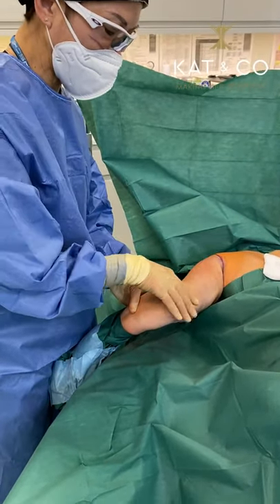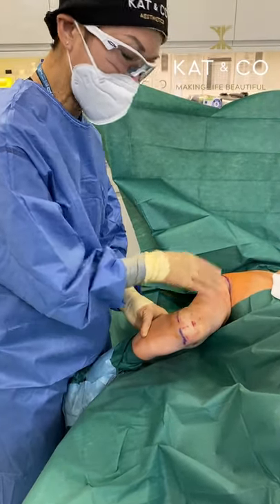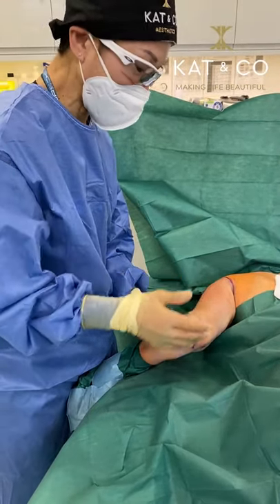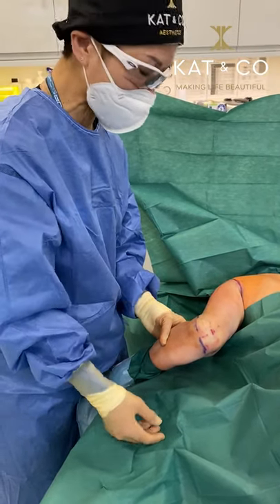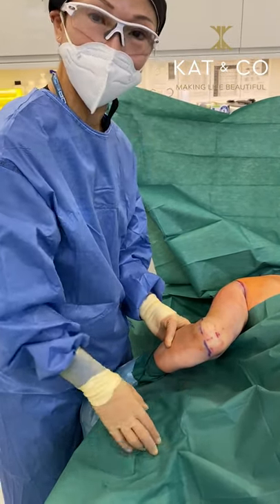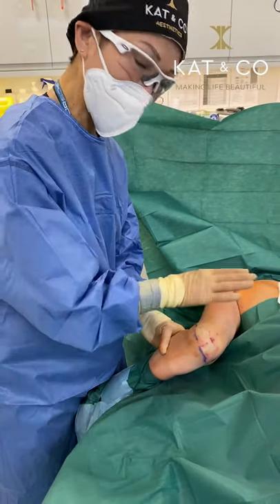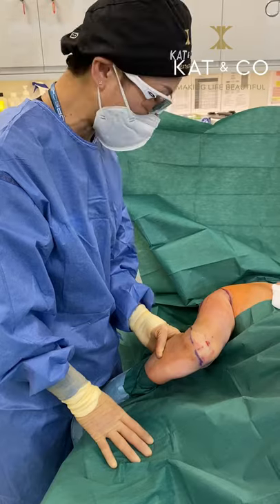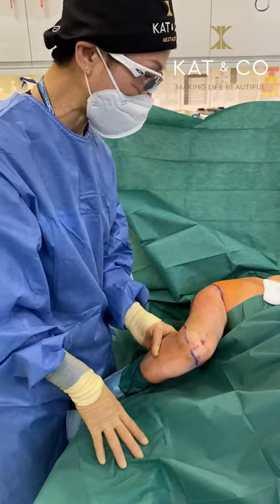We're finished, so you can see that the tissue is nice and thin. Hopefully with Lucy's skin elasticity a lot of the skin will shrink. If it doesn't completely then obviously we have other means to encourage the skin to shrink, like with the radio frequency device — that's called the Exodos 360 — which I have already warned Lucy about. We're just going to finish up on the right side now.